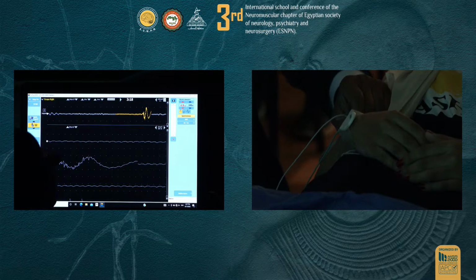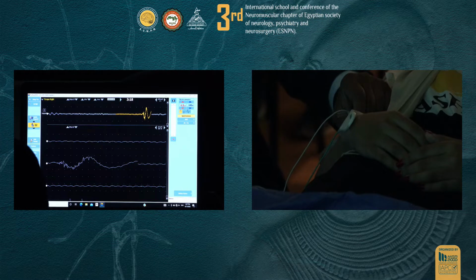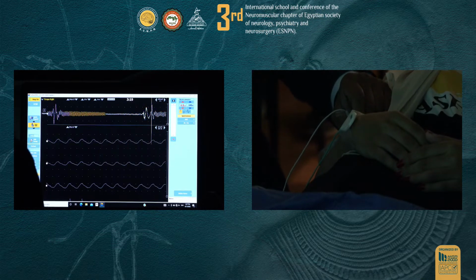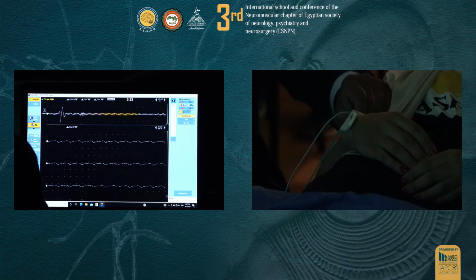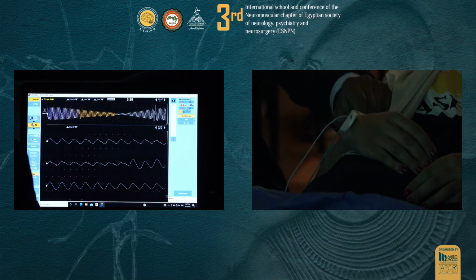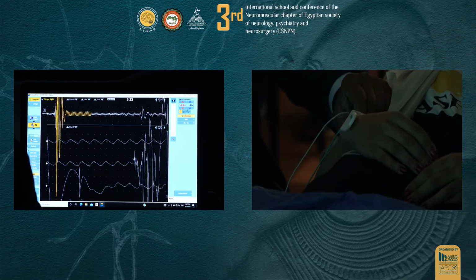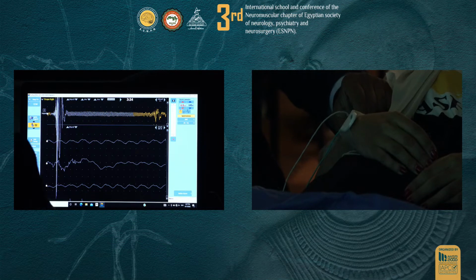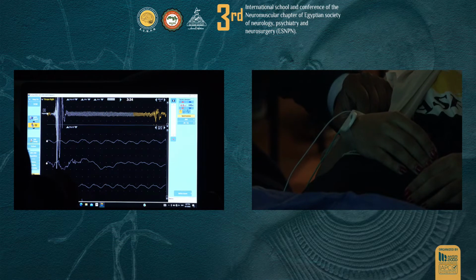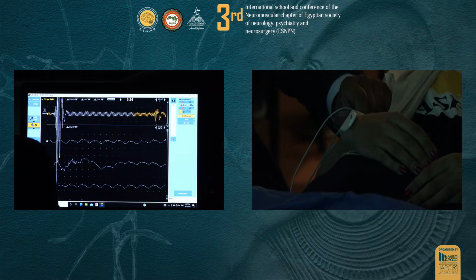So insertional activity is right after my needle movement, how long does it last? Okay, we'll try one more time. You need a good baseline for that, of course, and a silent, relaxed patient. So here's the insertional activity. That's my needle movement, 1, 2, 3, 4, about 400 milliseconds or so, okay? Let's try one more time.